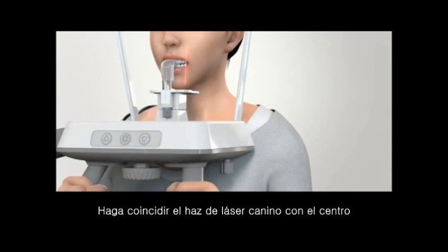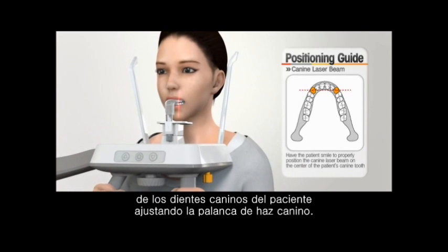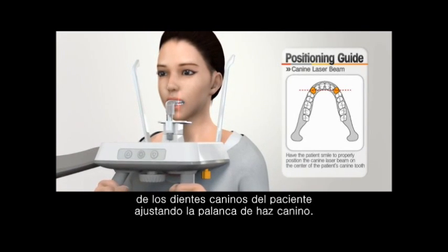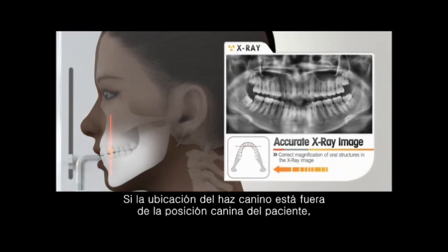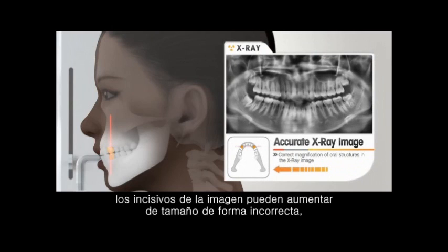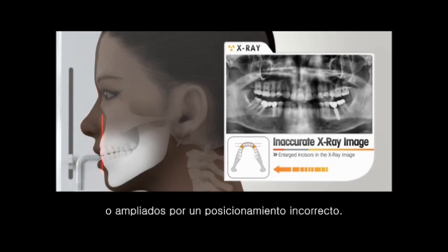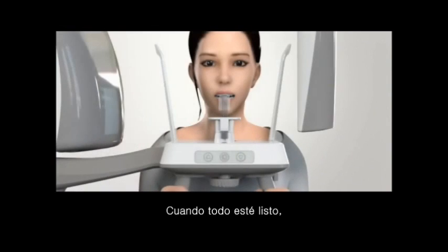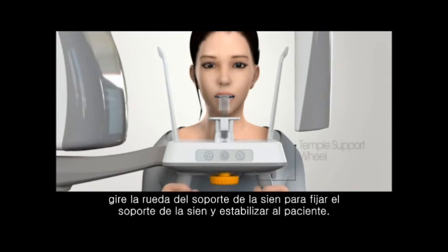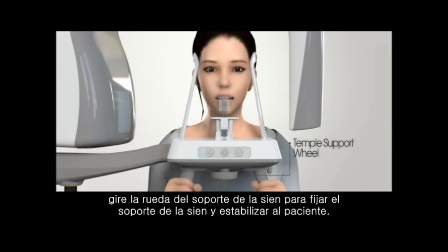Match the canine laser beam at the center of the patient's canine teeth, adjusting the canine beam lever. If the location of the canine beam is off the patient's canine position, the incisor image can be incorrectly magnified, which means reduced or enlarged incisor images are achieved by incorrect capture layer. When everything is ready, rotate the temple support wheel to tighten the temple support to stabilize the patient.